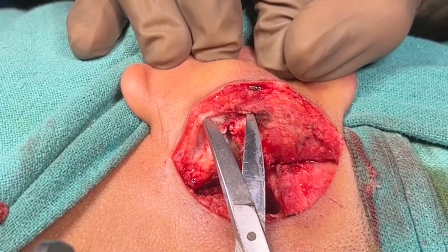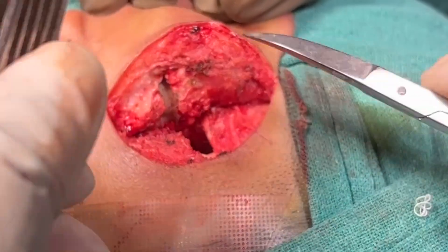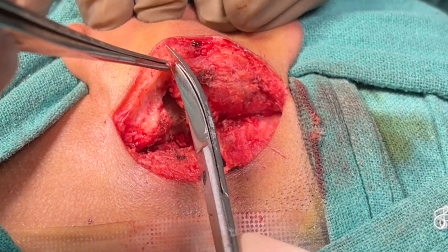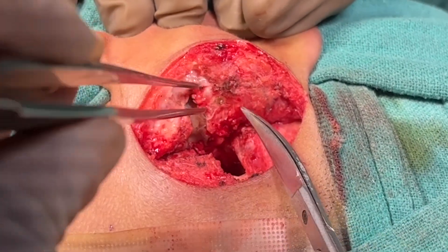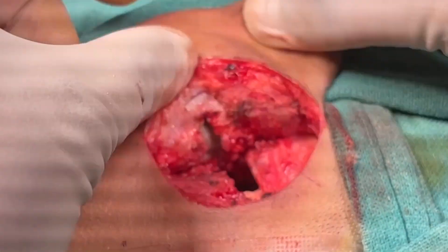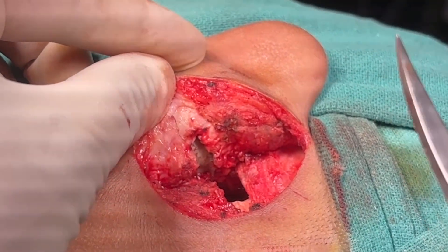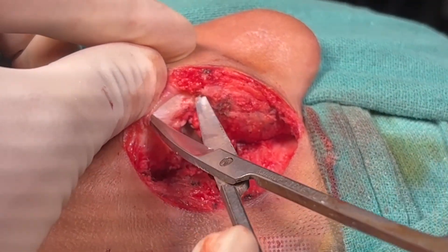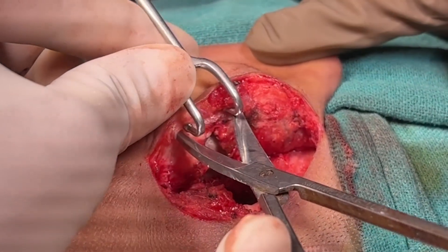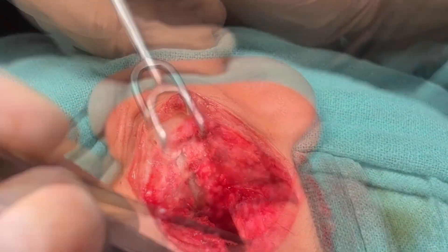We should also remove a piece of concheal cartilage so that we get a circular shape of the meatus. For this we have to remove the soft tissue beneath the concheal cartilage. We are separating the soft tissue from the concheal cartilage, and then we will remove a piece of concheal cartilage in a C-shape or crescent form.